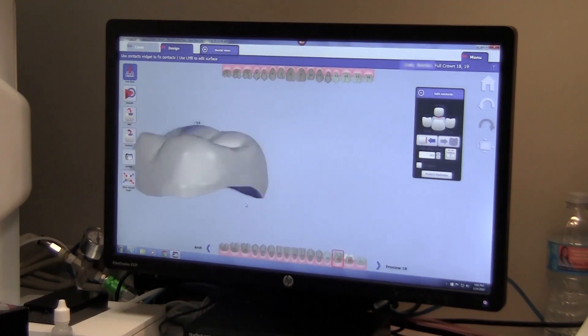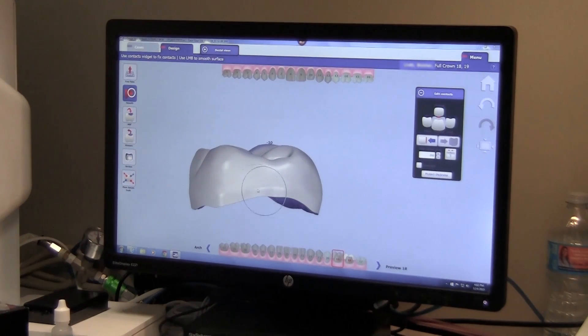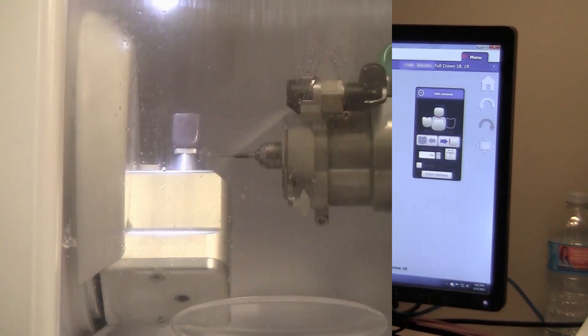Once I'm satisfied with the designs, I send this off to the TS-150. Each of these restorations takes about 15 minutes to mill. During that time, you could work on another patient or perform any direct restorations that need to be completed on the patient.